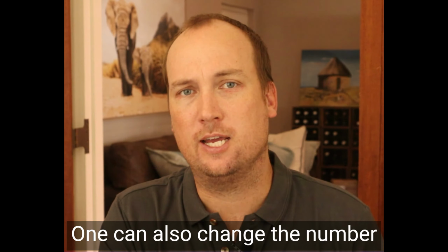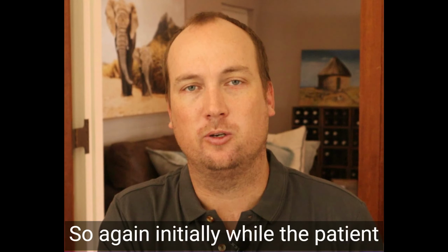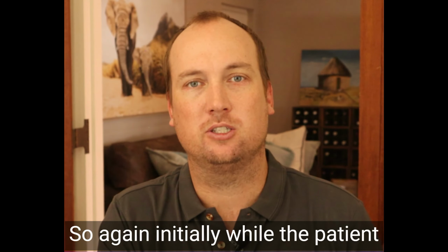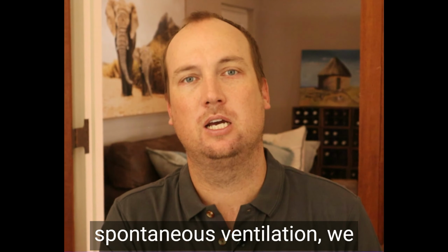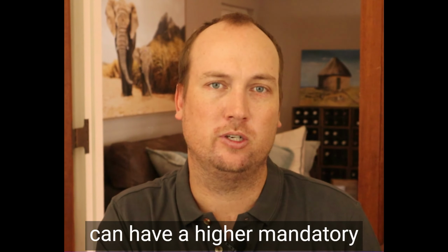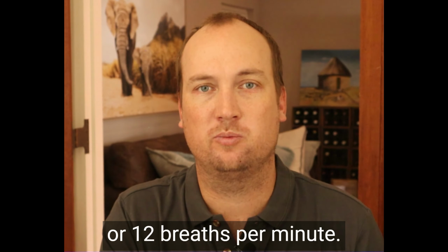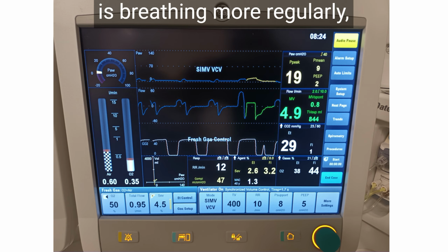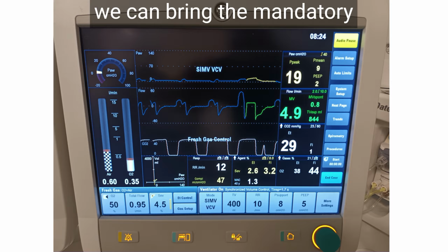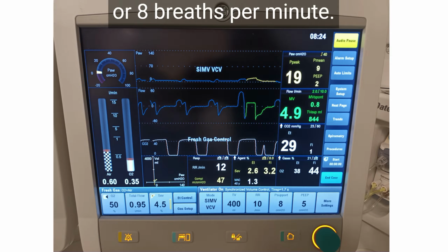One can also change the number of mandatory breaths per minute. So again, initially, while the patient is still establishing regular spontaneous ventilation, we can have a higher mandatory respiratory rate of, say, 10 or 12 breaths per minute. But then once the patient is breathing more regularly, we can bring the mandatory respiratory rate down to 6 or 8 breaths per minute.